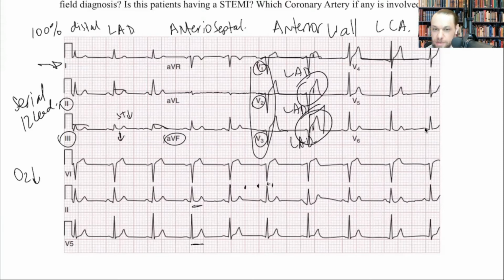Then let's say we are moving this person. Let's say you have this gap when you're driving. Let's say there's traffic, or you can't get through, like you stopped, right? You're still going lights and sirens to the hospital, but let's say there's a gap. I'll do another 12 lead, and I'll certainly try to get one the moment the bus is parked. I'll do another EKG.